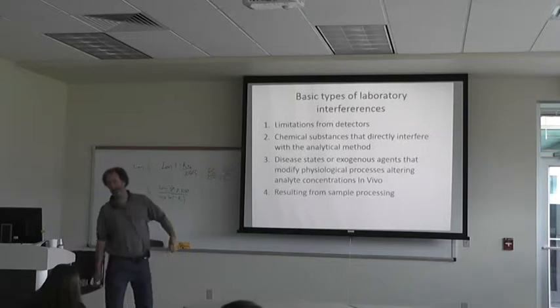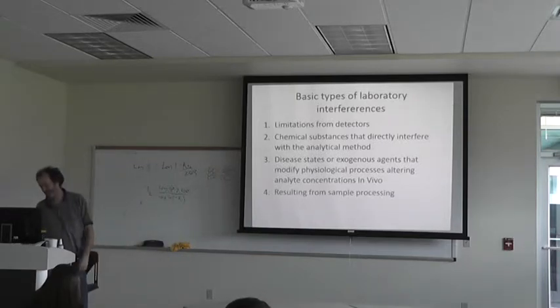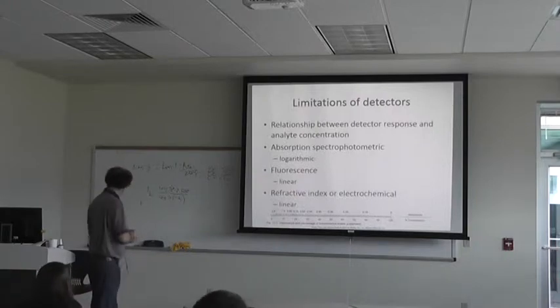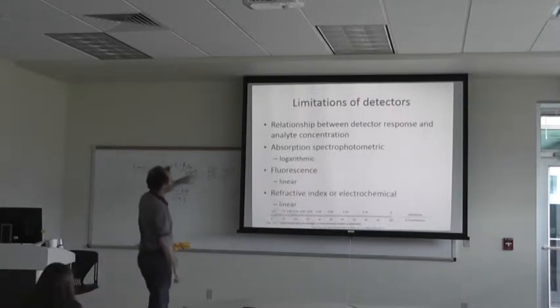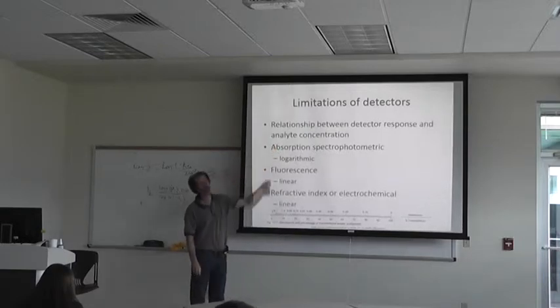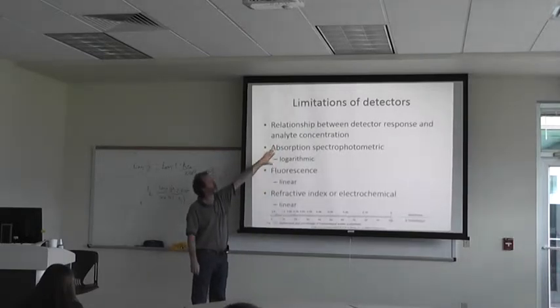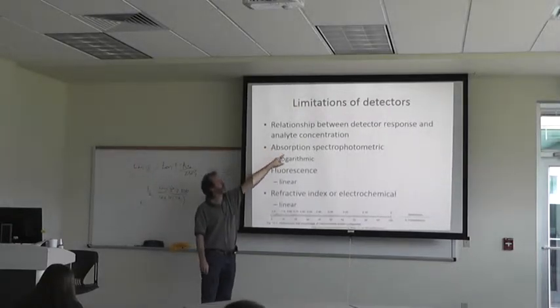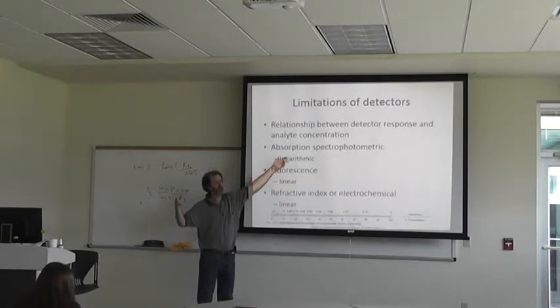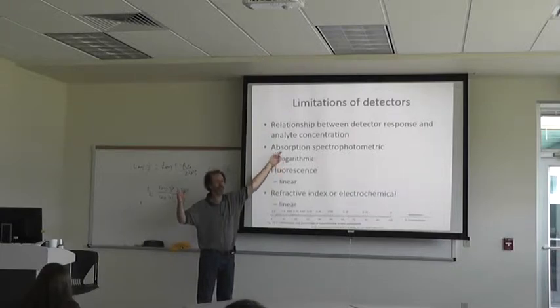So those are the basic laboratory interferences. Limitations of detectors — the relationship between the detector response and the analyte concentration. We can look at absorption spectrometers. What's the relationship between an absorption spectrometer's detector voltage and the concentration?